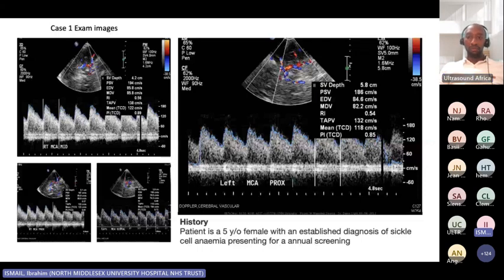So I would always, because the whole point is that we're looking for narrowing. So you don't offset areas of narrowing against areas that are not so much narrowed. So you always take the highest.